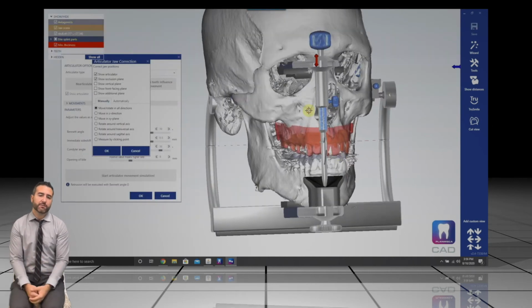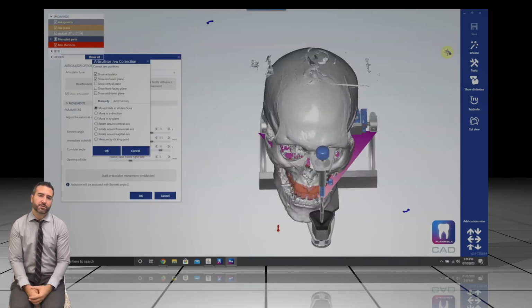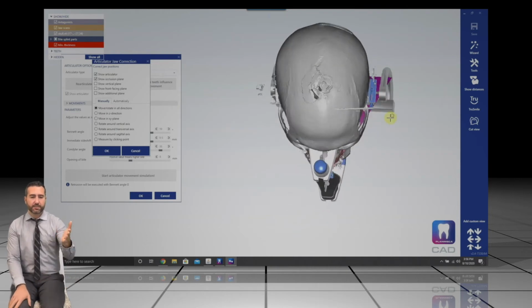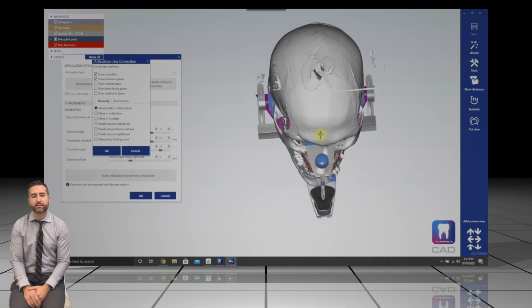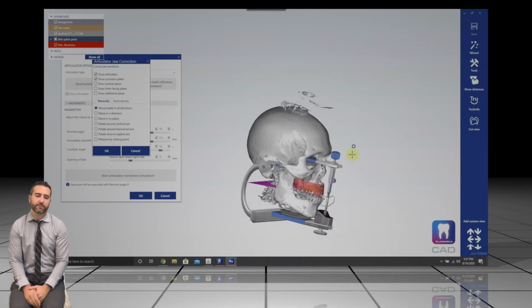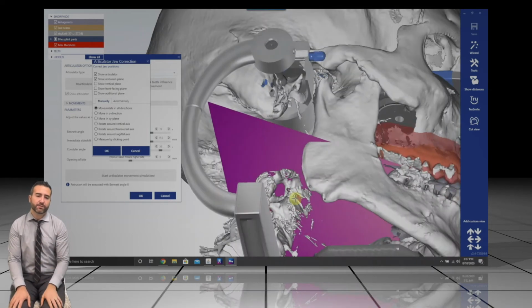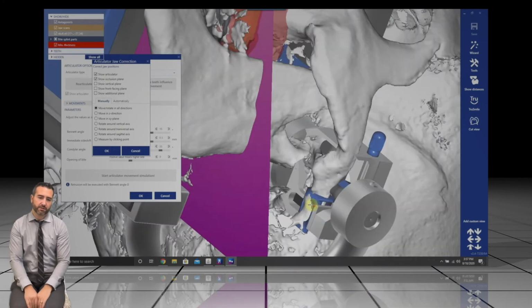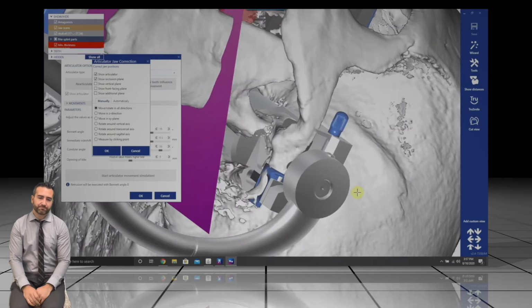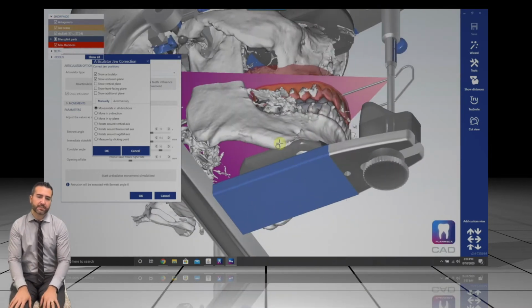And then we're able to pin their intraoral scans to the CBCT here, and now we're able to virtually mount this on the articulator using Bergstrom's point, which is about 10 millimeters anterior to porion and 7 millimeters inferior to Frankfurt horizontal. And we're also able to get the upper arm of the articulator parallel to Frankfurt horizontal or Camper's line. And so you can see we're actually dialing in.